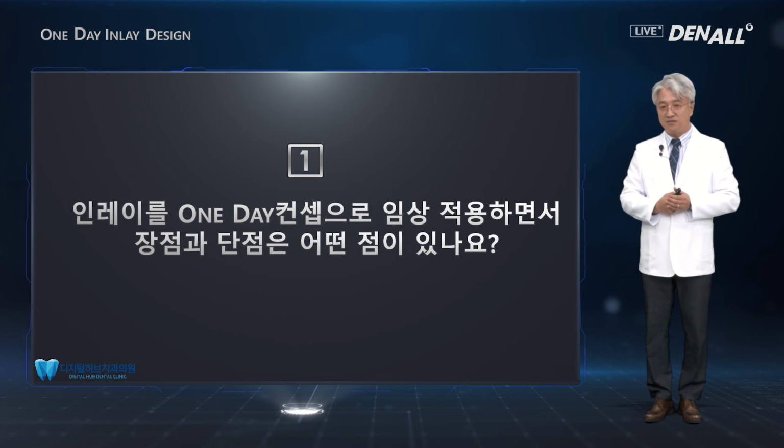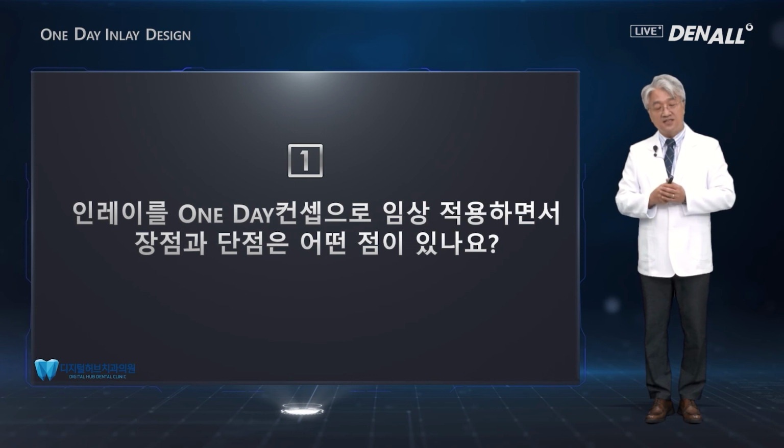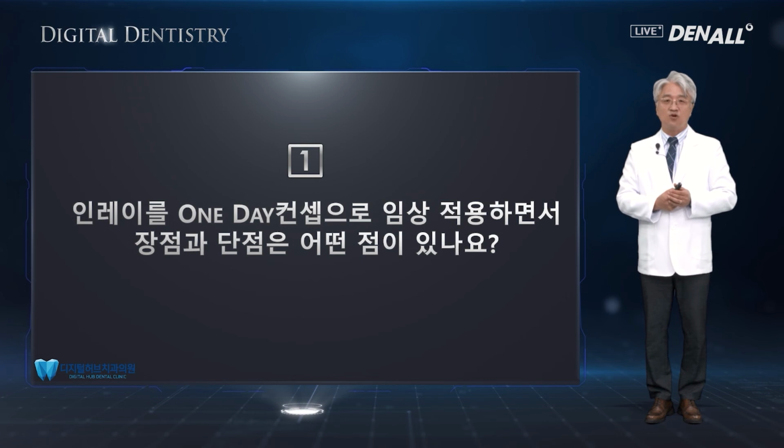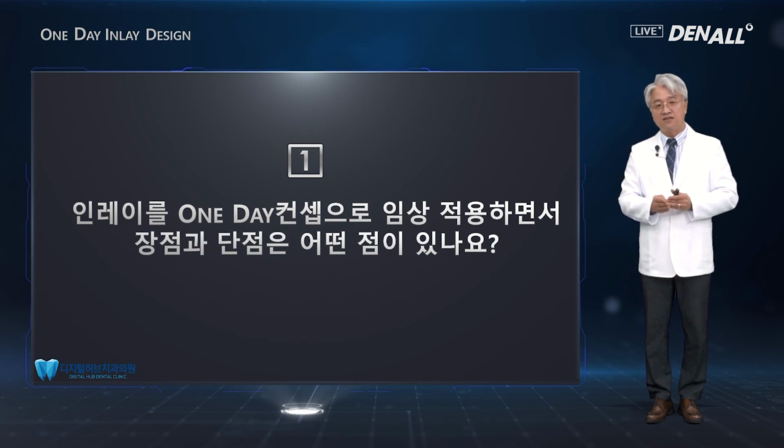But what are the disadvantages? First, with the resin printer or the milling machine or device, when you use the all ceramic or hybrid resin, the strength of these materials has room for improvement. And secondly, if you make an inlay with the CAD-CAM, then devices that you didn't need before, like milling device or scanners or design software, are now needed.